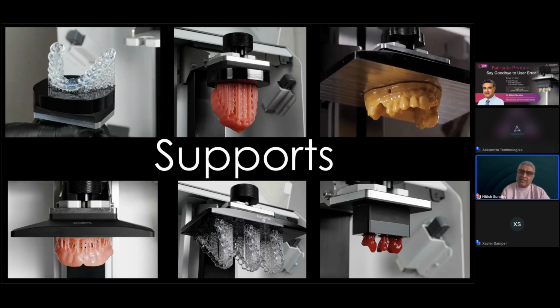This is important to understand because a lot of users will think, all right, I'm getting failures. Let me put 4 of these and at least one of them will print. That really is an issue where you're going to compound the amount of peel force, and that is only going to produce a higher risk of failure. And it's therefore not something you should be doing. You're far better off using one print again, and that stands the lowest risk of failure. Even better if you use a smaller platform as well, that will help things even become faster.